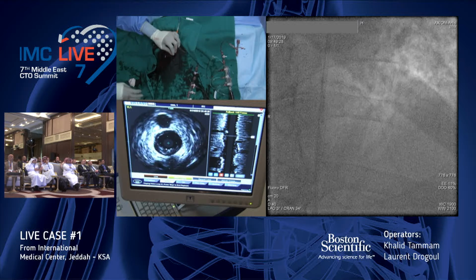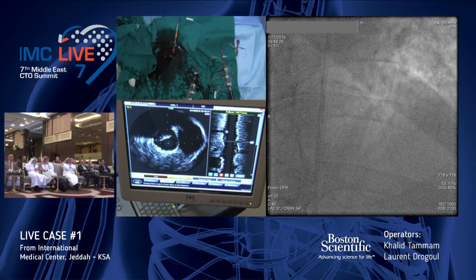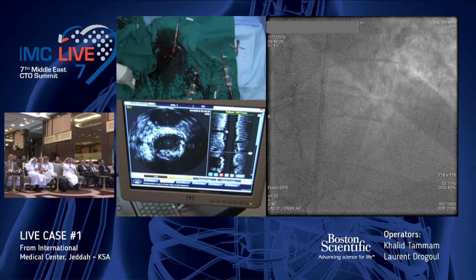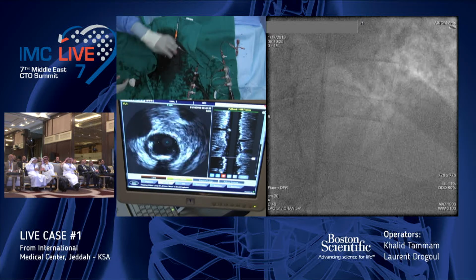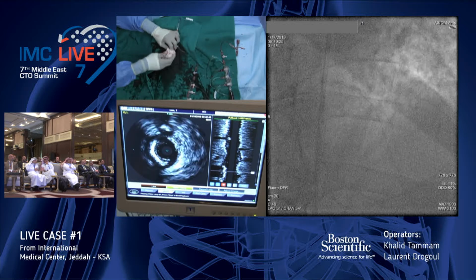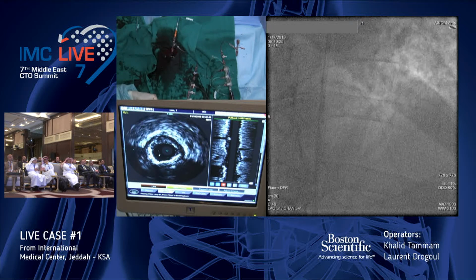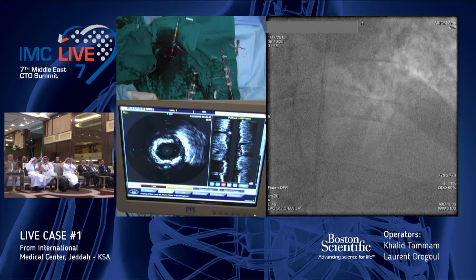For the moment, we can't hear Stéphane. So maybe Roberto, you can be our IVUS commentator.